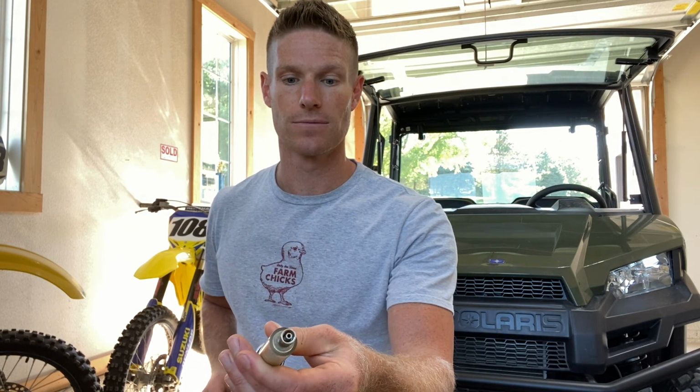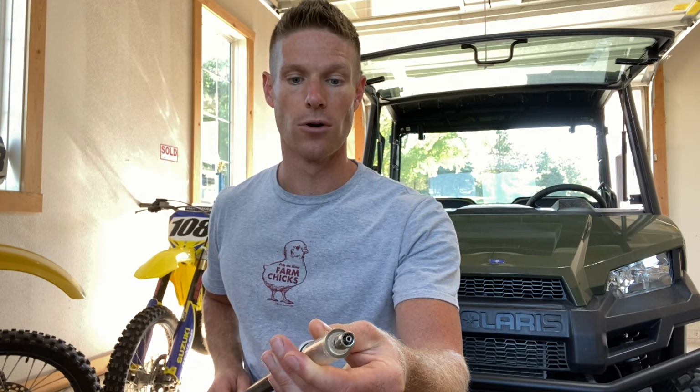I know a lot of places say for intramuscular injections for full-size cattle, 16 gauge, 1.5 inch is the way to go. You can get to 18 gauge, 1.5 inch when you're dealing with calves, or maybe even 20 gauge. But again, you have one shot to basically come up to the animal, hit them, and then make that injection before the animal takes off. So 16 gauge, shot that medication in there really, really nicely.